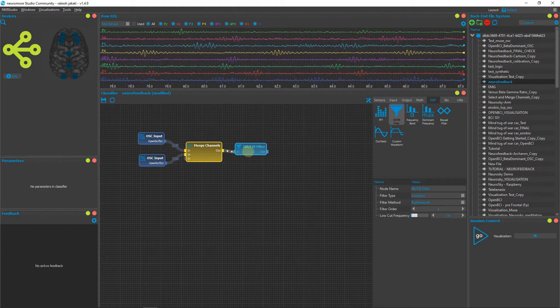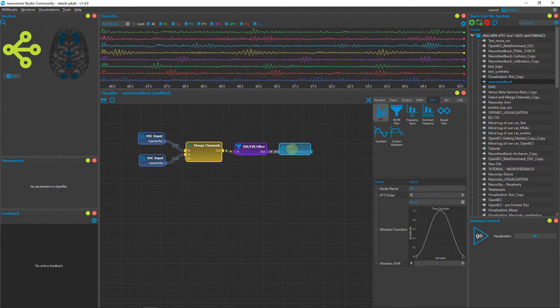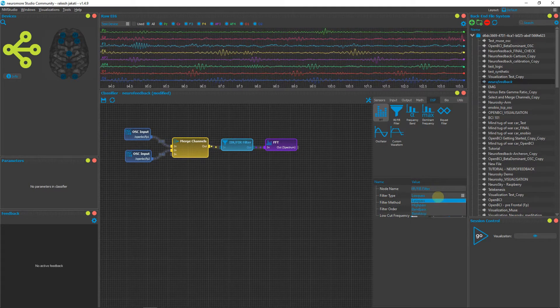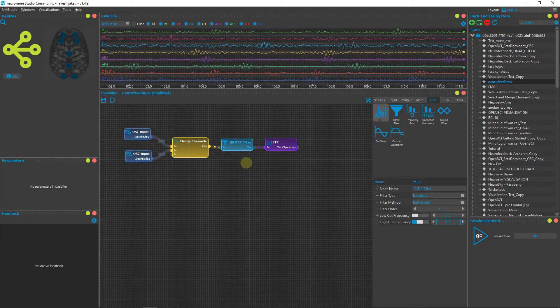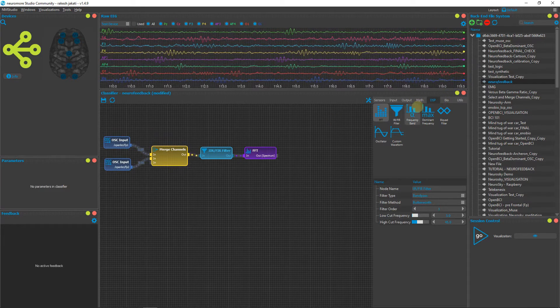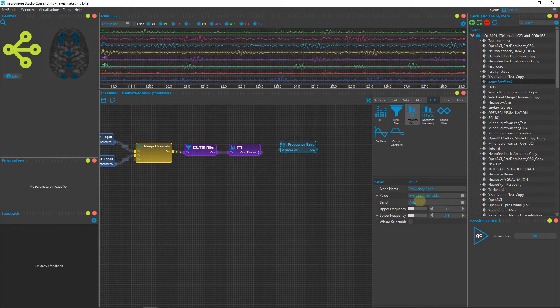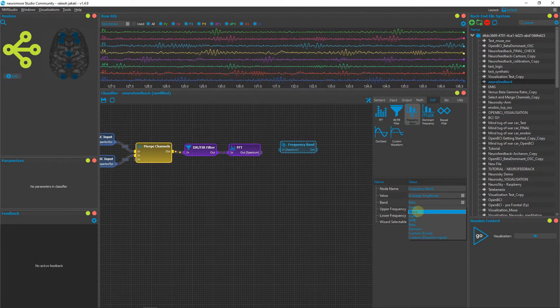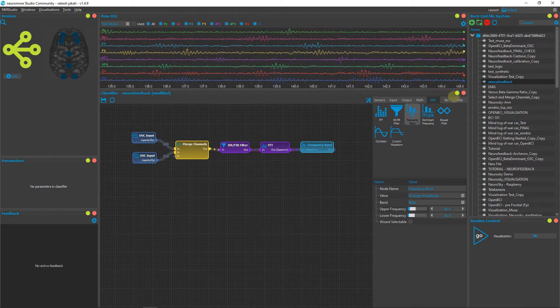Next, connect the FFT node. The OpenBCI signals are in the time domain and we need to convert them to the frequency domain for further operations. Before connecting FFT, change the IIR filter settings: set the filter type to band pass, lower cutoff frequency to 1, and higher cutoff to 45 Hz — this removes line frequency noise. Then go to the DSP tab again and select Frequency Band. For this demo we'll use beta, but you can select theta, alpha, or beta based on personal preference. Connect the output of FFT to the Frequency Band node.